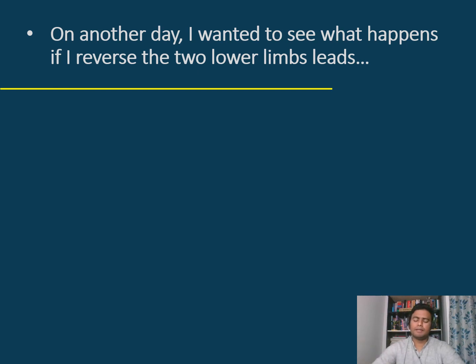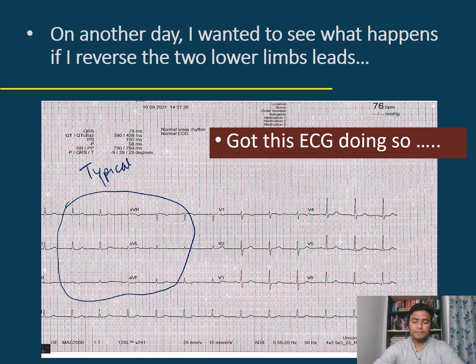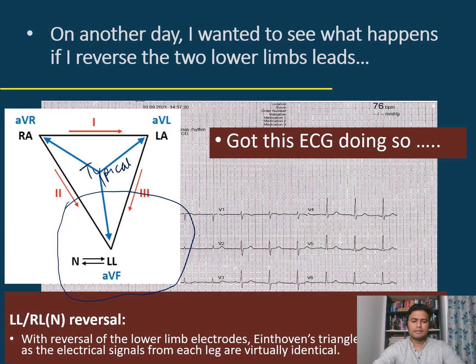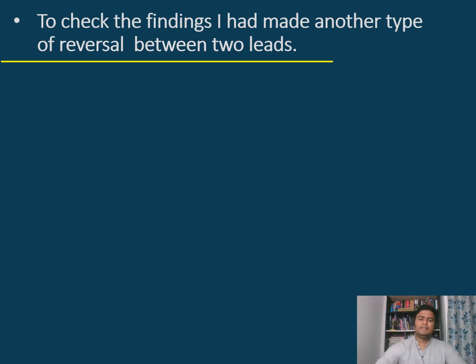On another occasion, I wanted to see what happens if I reverse the two other limb leads — the right leg and the left leg leads. I obtained this ECG by doing so. All limb leads appear typical or normal — there is actually no change when the right leg and left leg leads are switched. This can be explained by the Eindhoven triangle: if you reverse the neutral lead with the left leg lead, the Eindhoven triangle is preserved and the ECG is virtually normal. It makes no difference to ECG interpretation.